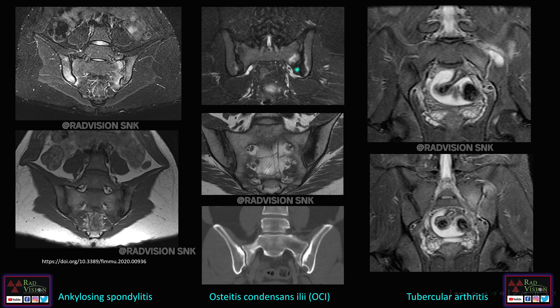This is the second case, which also mimics sacroiliitis. Here you can see there is predominantly sclerosis involving the iliac aspect. On CT, you can see sclerosis predominantly involving the iliac aspect, but there are no typical erosions or destruction of the joint space. This was a case of osteitis condensans ilii, which mimics both sacroiliitis and ankylosing spondylitis.